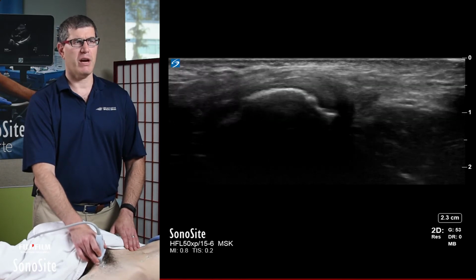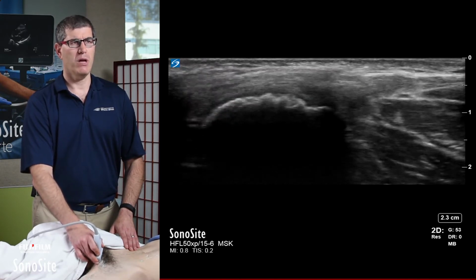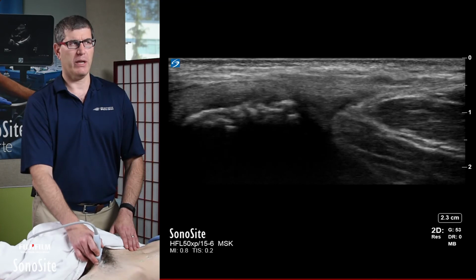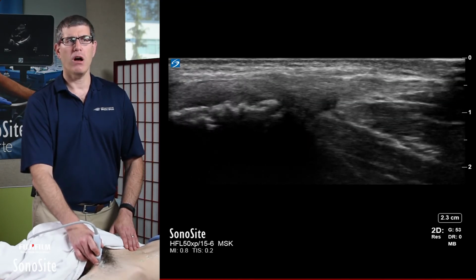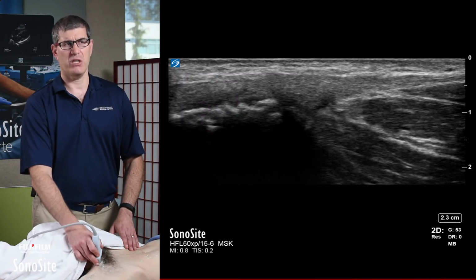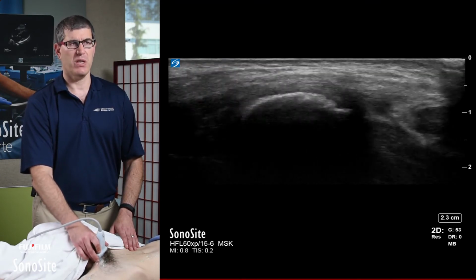So in this plane right here, you can see relatively smooth bone, but in this plane, you see some cortical irregularity. And that cortical irregularity may be because of abnormal pull of either the adductor longus tendon or the rectus abdominis.